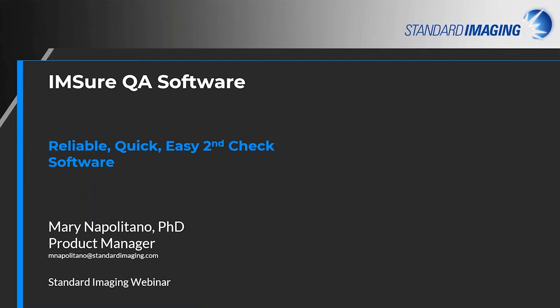Hello, my name is Mary Napolitano, and it's my pleasure to talk to you today about Standard Imaging's IMSure QA software. I'm the product manager for IMSure. In short, IMSure is second check software that is reliable, quick, and easy to use.